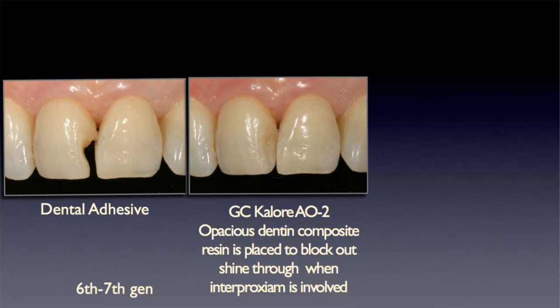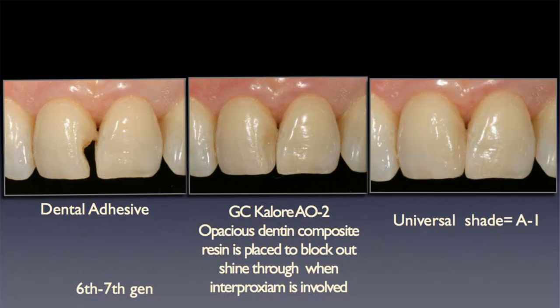Then I'm going to do some internal striations to create better natural reflection, refraction, and absorption of light. And then after I do that with the body shade, I'm going to layer this neutral translucency along the surface, and so I'm able to create a good depth of shade.